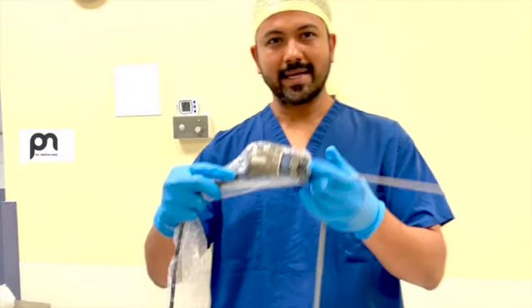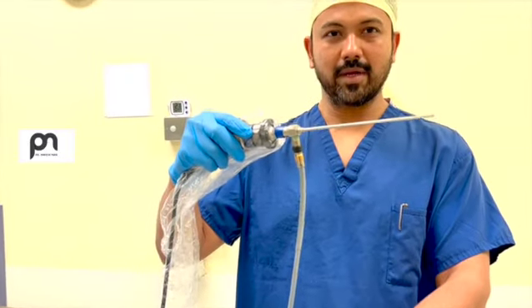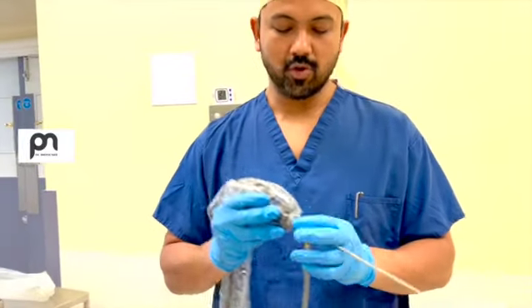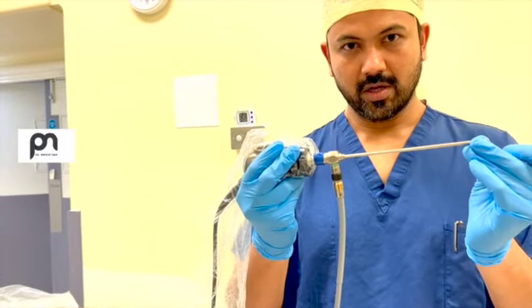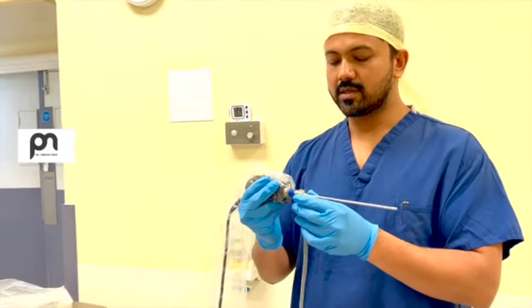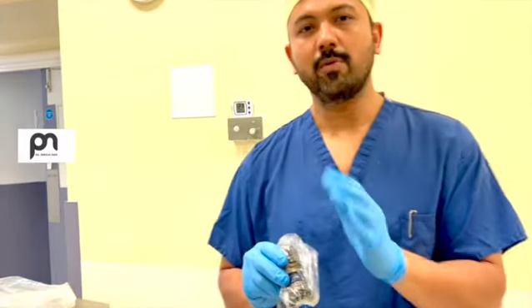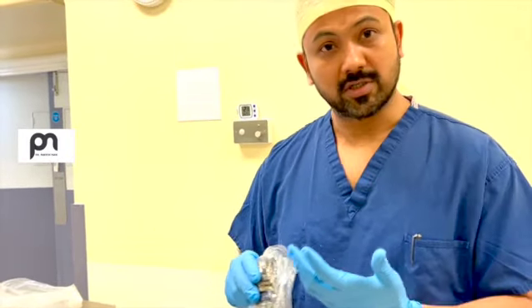This is the endoscope as it is when we are operating. Endoscope, the cable and the camera. The camera is usually covered with a sterile cloth. Okay, so how do we hold this? Remember, now this is a 0-degree endoscope. So you'll have 30 degrees and also a 70-degree scope if you need it. So how do you hold it? The whole purpose is you should not put extra efforts to hold it.